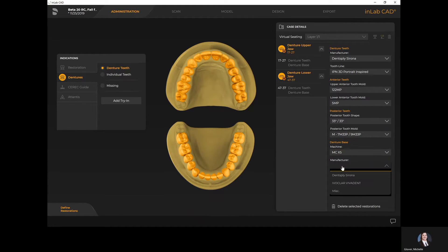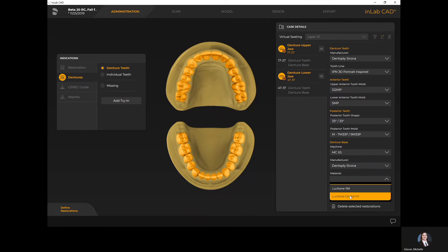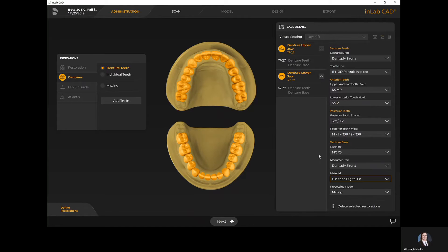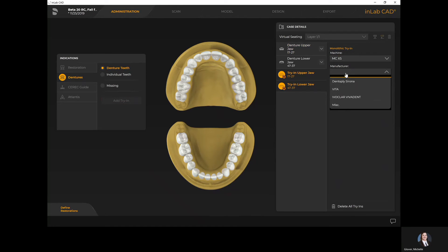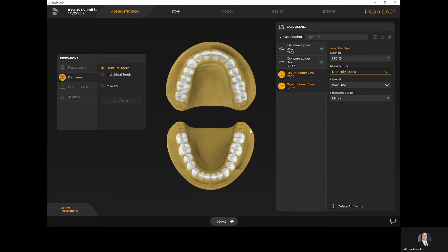Then I select what I'm going to be manufacturing my denture base out of. Even if you are not milling, it's always good to give the software an idea of what type of material you'll be working with. In this case I've selected the MCX5 by Dentsply Sirona for milling and identified the Lusitone Digital Fit. I also have the ability to add a try-in — I can identify if I want a monolithic try-in to be designed at the end of the software before exporting the case.